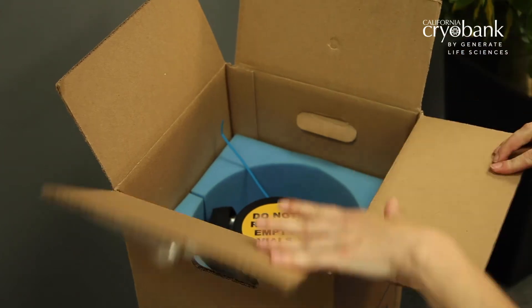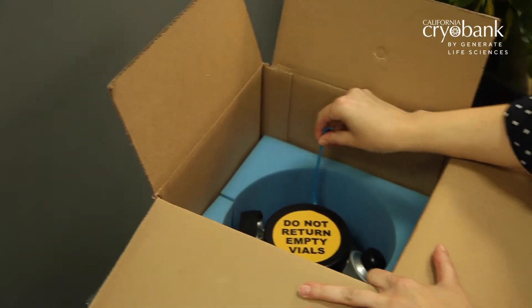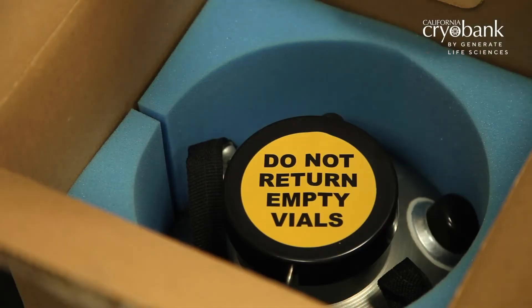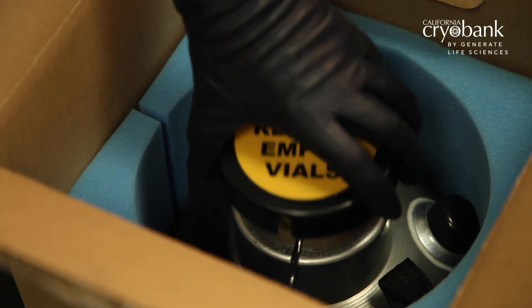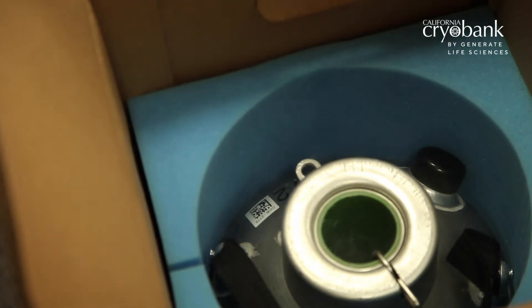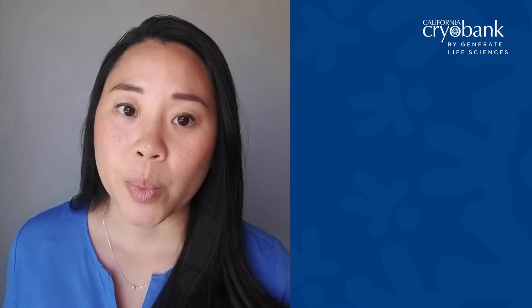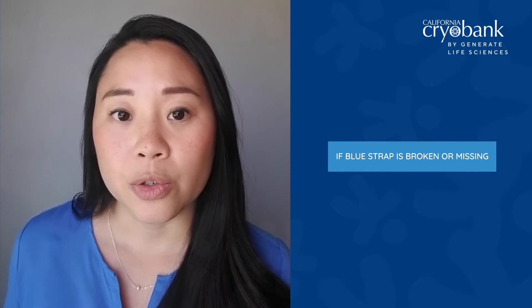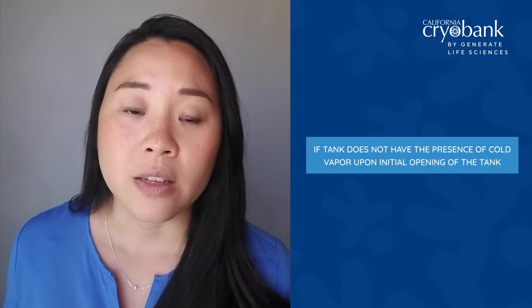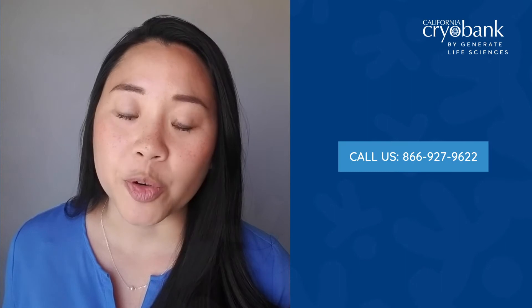Verify that there is a blue sealed strap securing the tank lid to the tank. Safely cut the blue strap with a pair of scissors. Using an upward motion, lift the lid of the tank — do not twist the lid. It's perfectly normal to see some cold vapor or smoke from the tank when the lid is open. If you're not proceeding with the insemination process right away, securely close the lid until you're ready. If you notice that the blue strap is broken or missing upon receipt of the tank, or if the tank does not have the presence of cold vapor when you first open the tank, please call us immediately before proceeding.